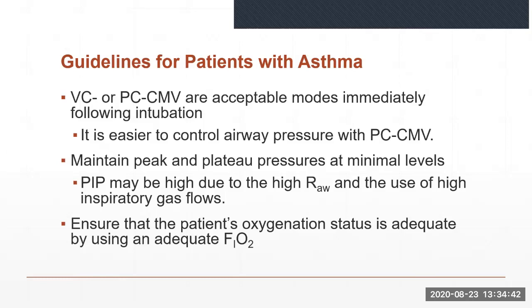The primary goal during mechanical ventilation of these patients is to focus on reversing the high airway resistance while avoiding or reducing air trapping. If the patient has anxiety and the drive to breathe produces patient-ventilator asynchrony during mechanical ventilation, then sedation and possibly paralysis may be required.